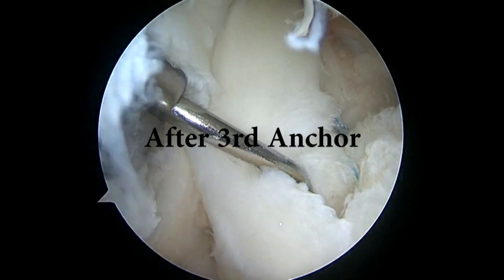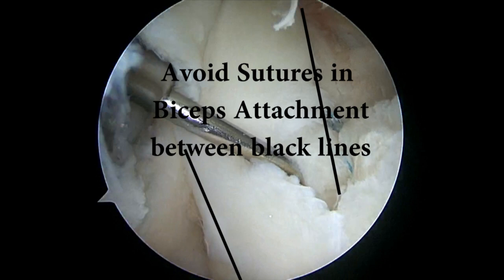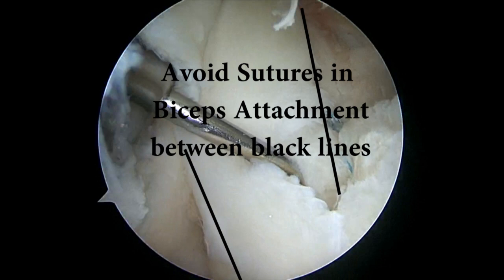Once that's been placed, we have a good stable repair of the SLAP lesion. The key is to avoid sutures in the biceps attachment between the black lines. You want some movement of the biceps tendon. And this is our final repair.